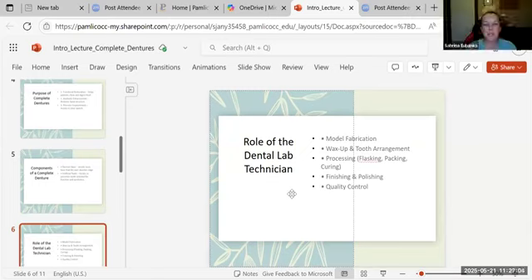So this is a special tray. Send it back to the dentist and they will take the final impression. Now the final impression will be much better than the primary impression, or first impression. They take the final impression and send it back to you, and because the patient lost their teeth a long time ago, they lost the support, vertical dimension, horizontal dimension, and we need to measure all these. So we have to create a device.